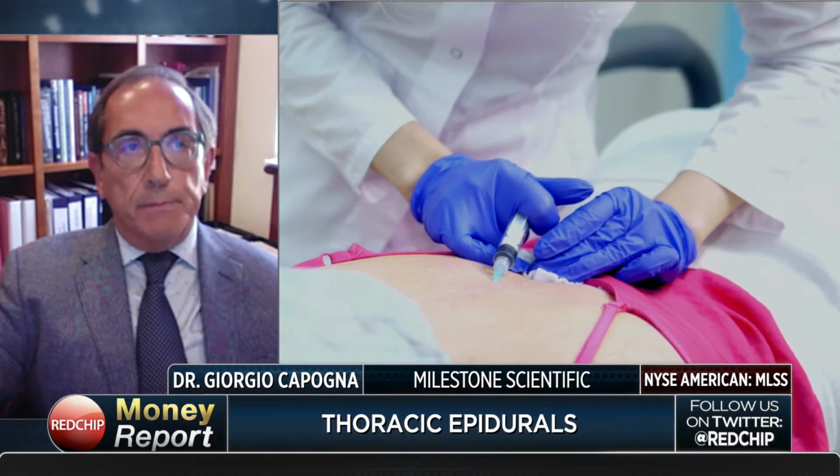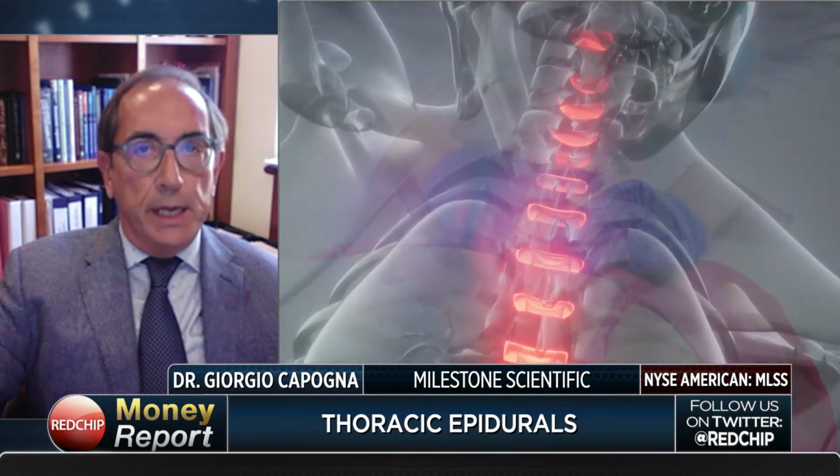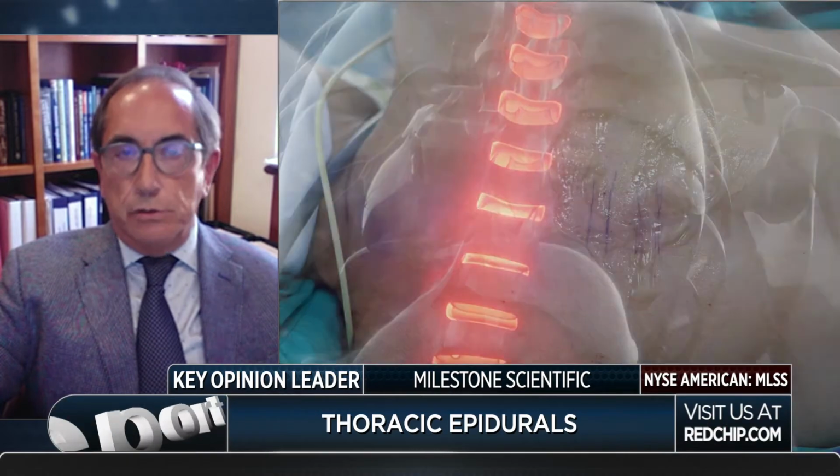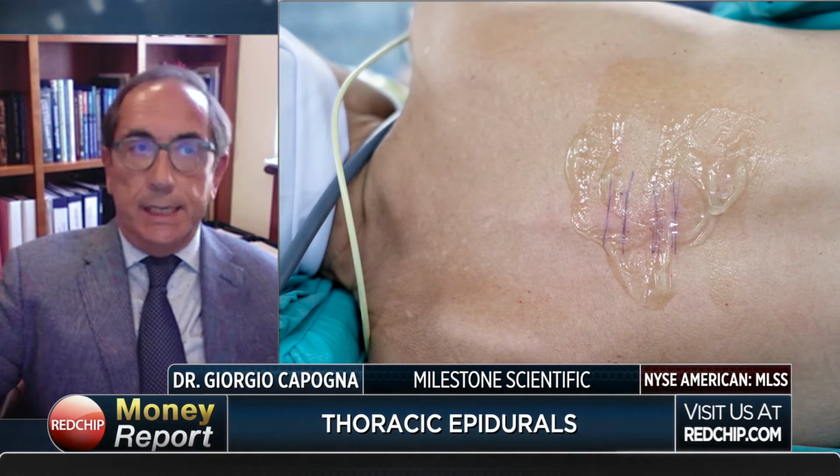First of all, though, can you explain to us what a thoracic epidural is? What's the difference, if any, with the lumbar epidural, and how is it practiced? Yes, a thoracic epidural is an injection into the epidural space, which is the area around the spinal cord. It can be a single shot injection, and in this case, it can be used to treat pain in the upper to the middle part of the back, or it can be used during surgery for thoracic and upper abdominal areas as an anesthetic technique.